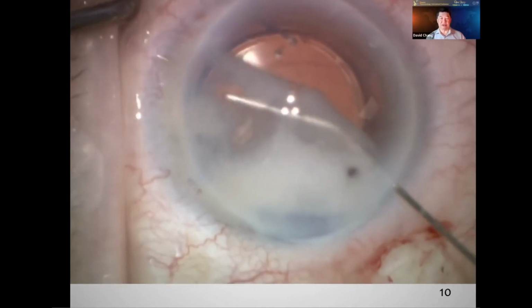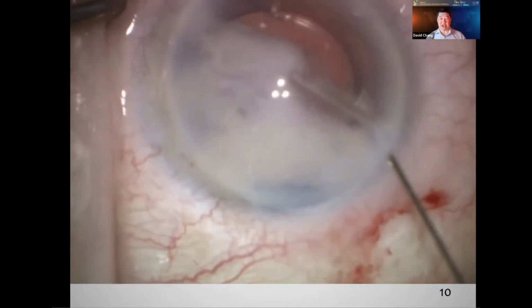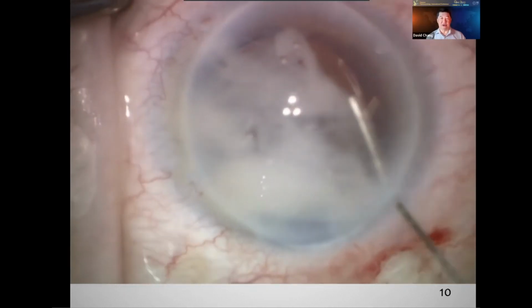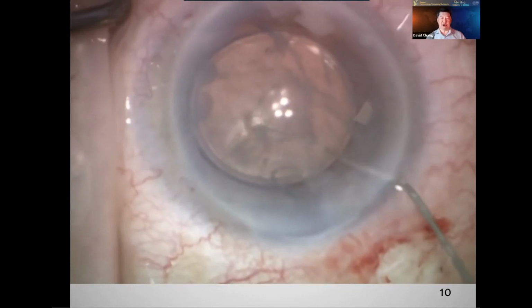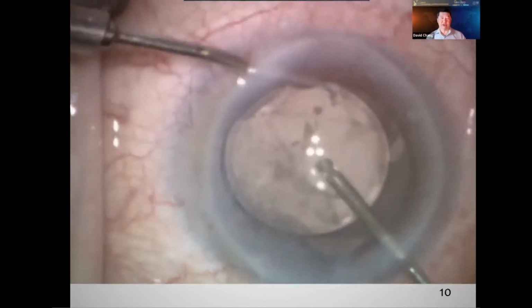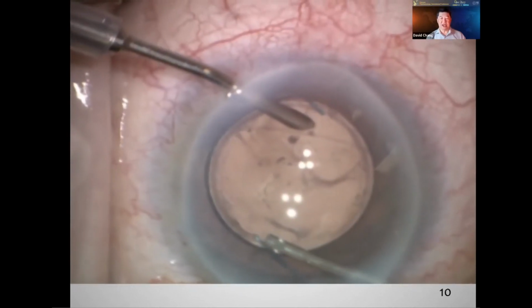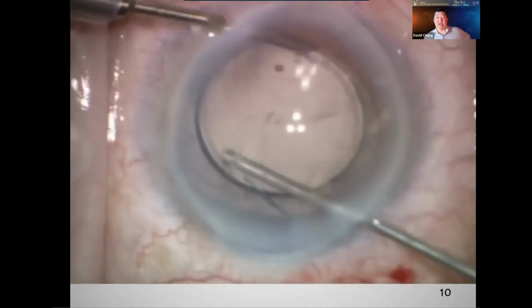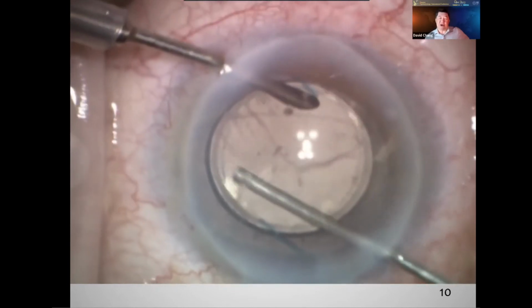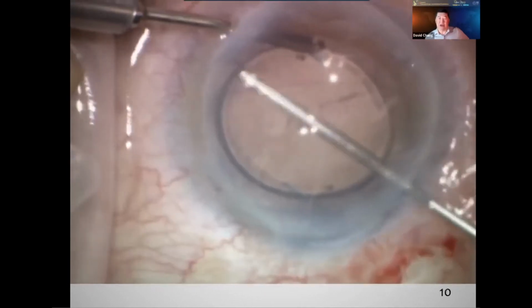And then I'm using some triamcinolone really at the end as a final check to make sure that there's no remaining vitreous prolapse. And this, along with constricting the pupil, confirms to me that we are in good shape. Again, I can go through the limbus like bimanual INA, but only with the vitrectomy, the small gauge vitrectomy, and I'll close the pars plana sclerotomy with an 8-0 vicryl suture.